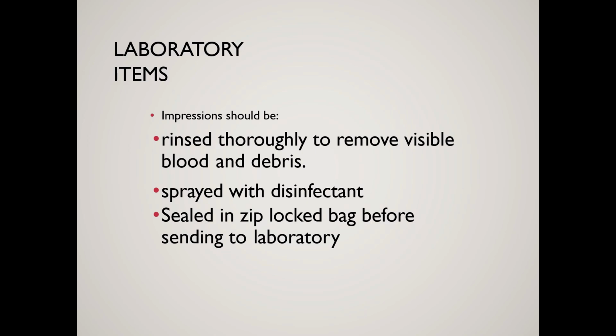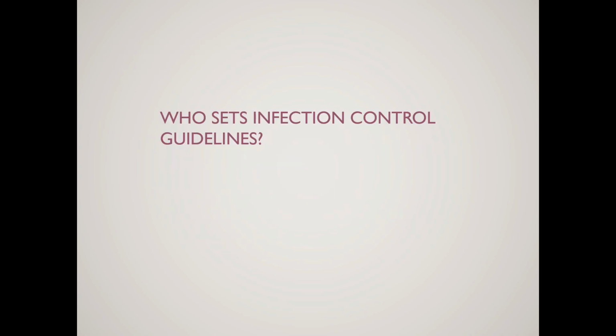Laboratory items. Impressions should be rinsed thoroughly to remove visible blood and debris, sprayed with the disinfectant, and sealed in a Ziploc bag before sending to the laboratory, to prevent infection.